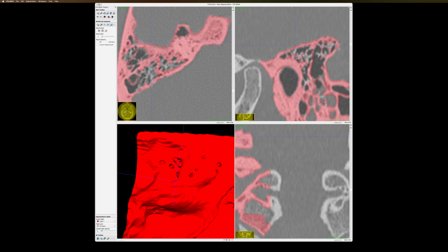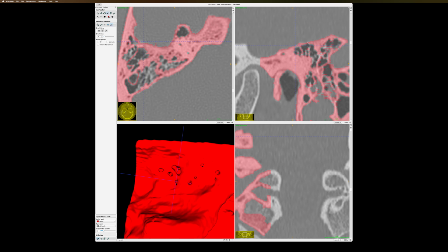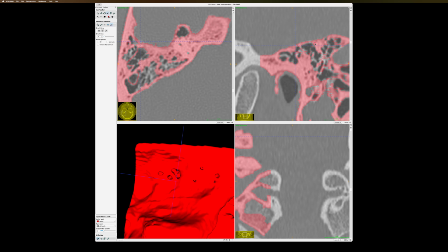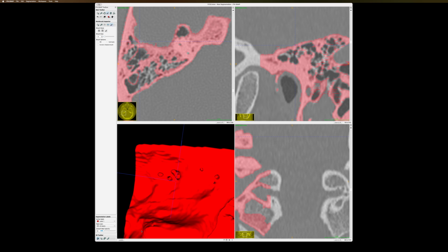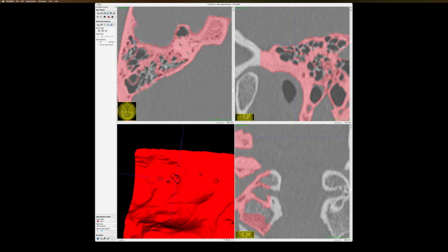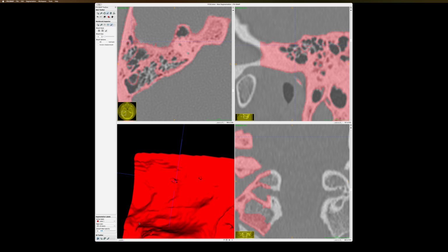It's much improved from the beginning, but there are still some imperfections. It's very satisfying to see them being fixed quickly and nicely.